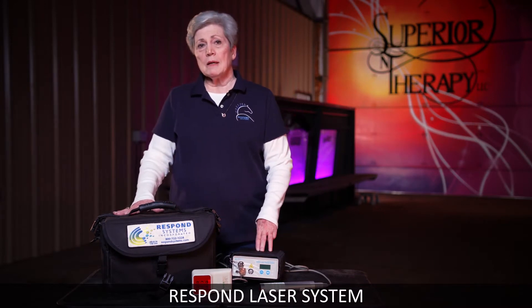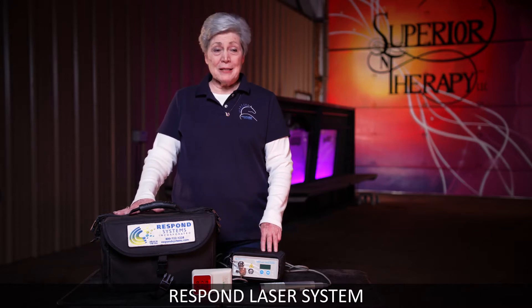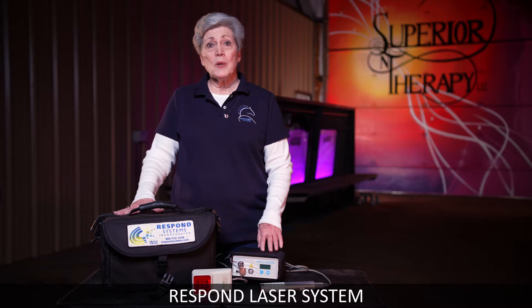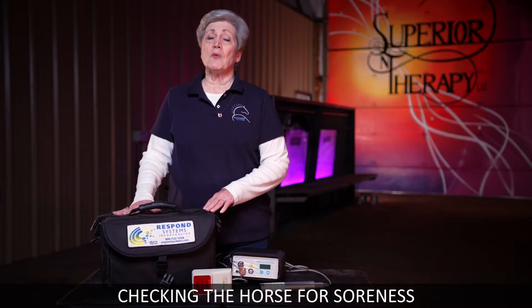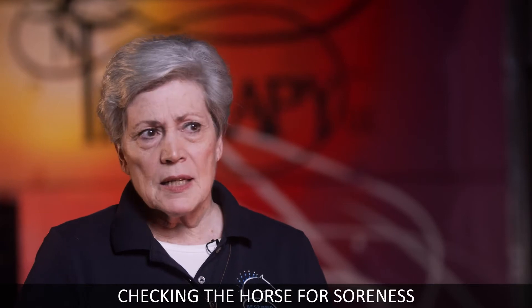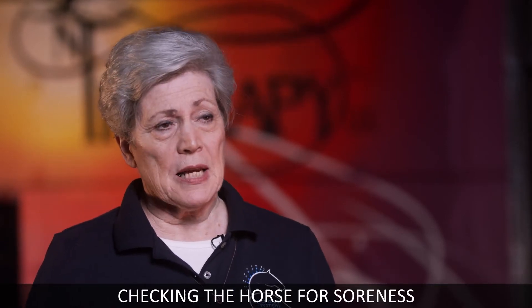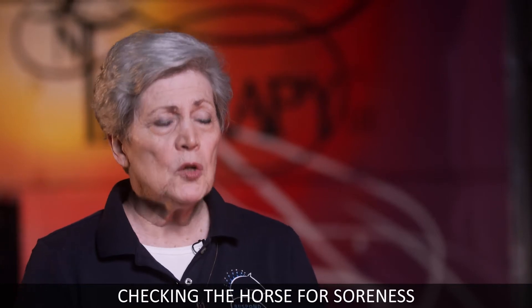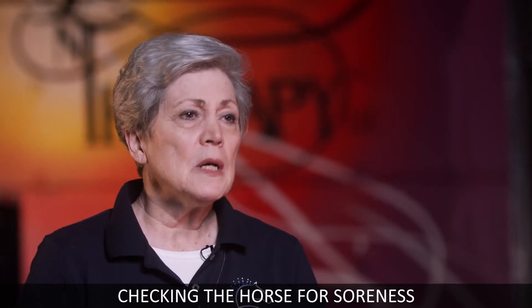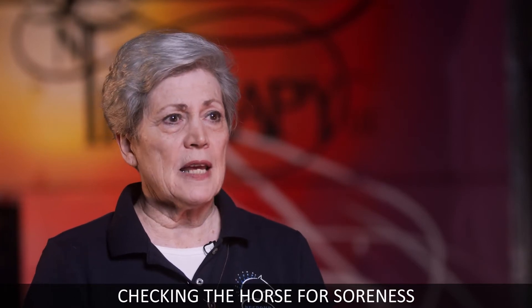The most asked question we get is: how do I check my horse to know where he's sore? This does not take the place of a vet, and it does not take the place of a wonderful setup like here at Superior Therapy. But you want to be able to check your horse and know if there's something wrong with it. I'm going to show you how to do that.